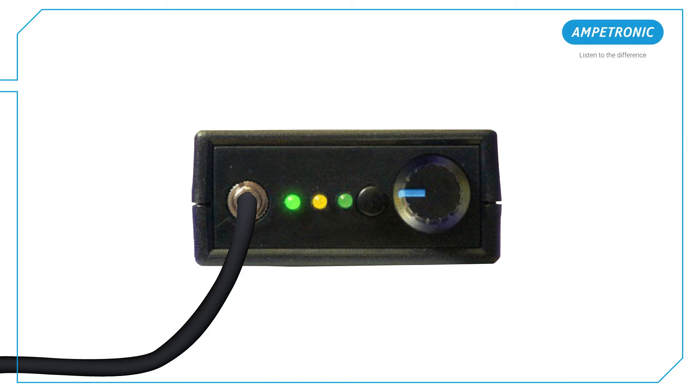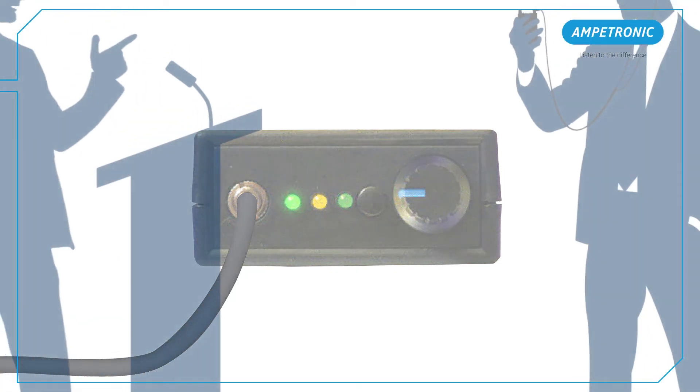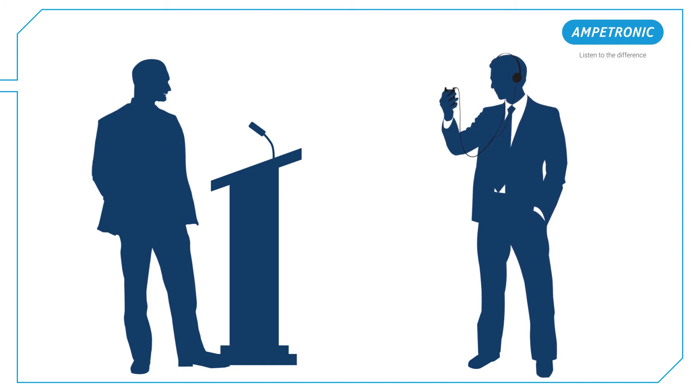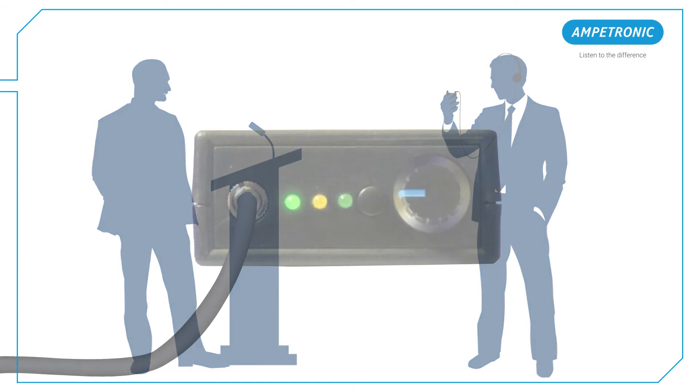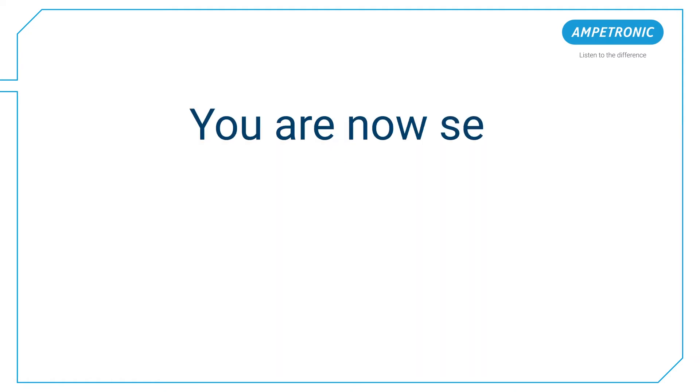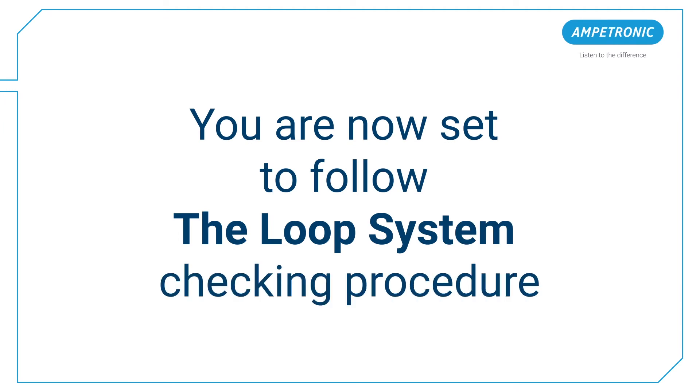Ensure the loop system has normal sound entering the system. You may need someone to speak at the typical position of the talker into the hearing loop microphone, so that the loop system receives sound as it would in normal use. Turn up the ILR3 Plus volume control to halfway. You should clearly hear the sound from the induction loop system. You are now set to follow the loop system checking procedure.